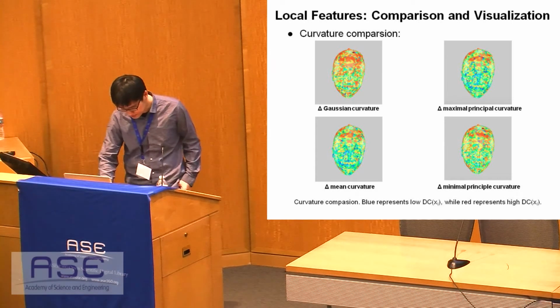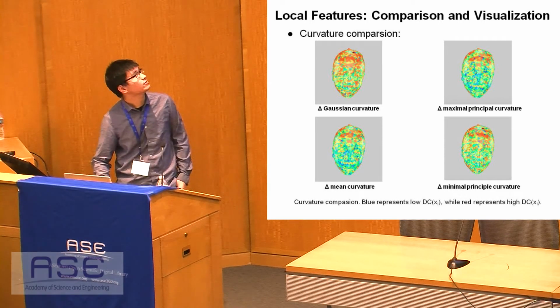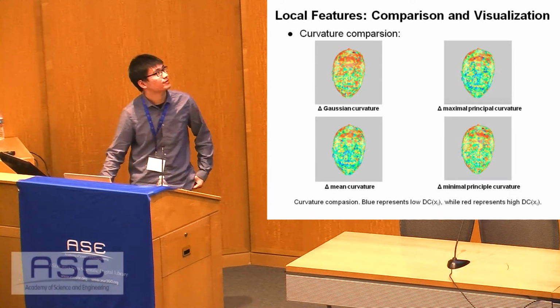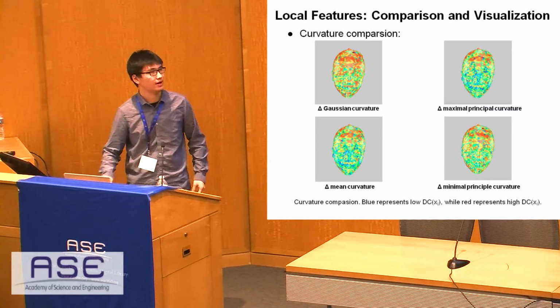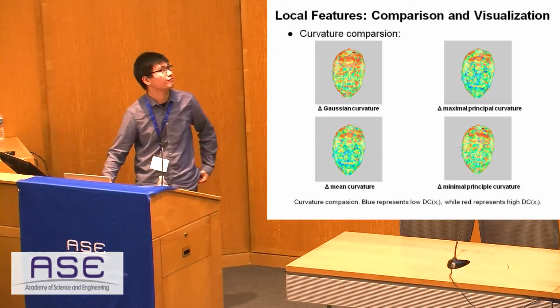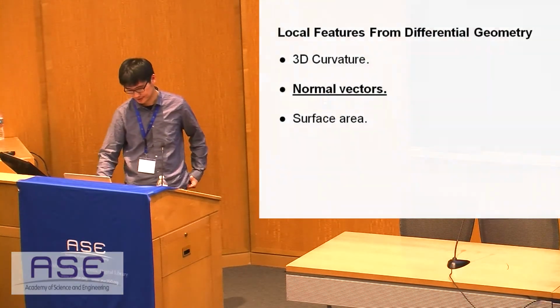But here I just want to mention that in this visualization result, the blue part means there's more change in this part of the head, while the red value means it keeps quite well. So in general, for this patient, the surgery is done on the front of the head. You can see in this part there's a small red value, and this is what we are expecting.